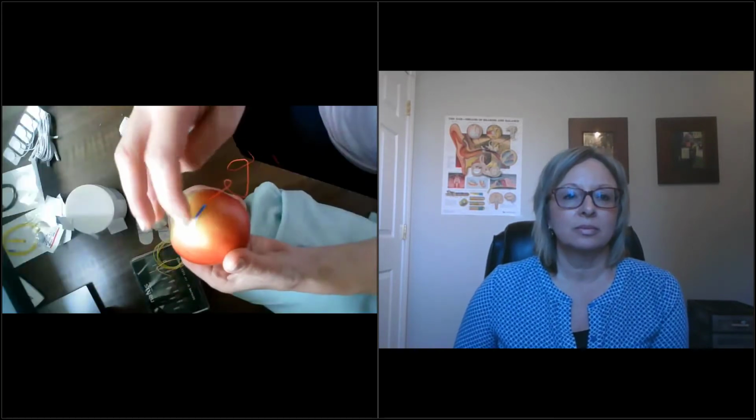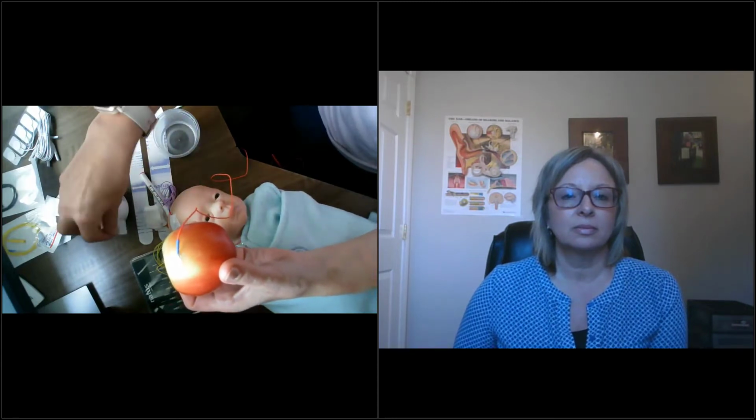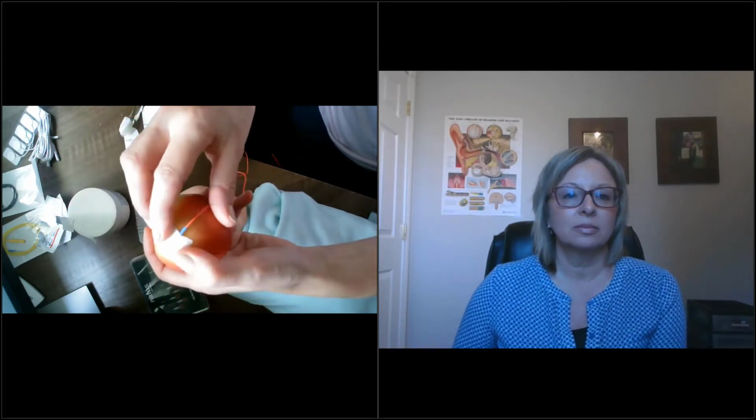Do you have any recommendations on trying to prevent needle sticks when removing the needles? Yeah. Let me take my piece of fruit and swap the camera again, and let's take an example of removing the electrodes. I have my electrode, my Steri-Strip, and potentially a piece of tape over the top of that also.